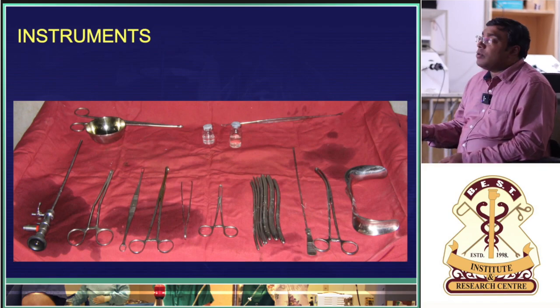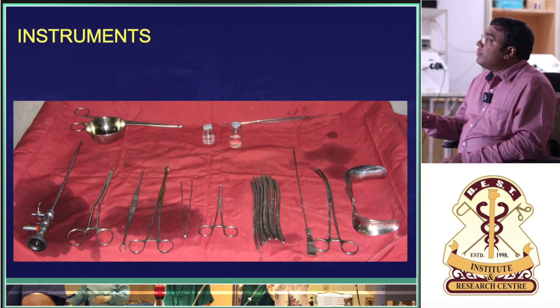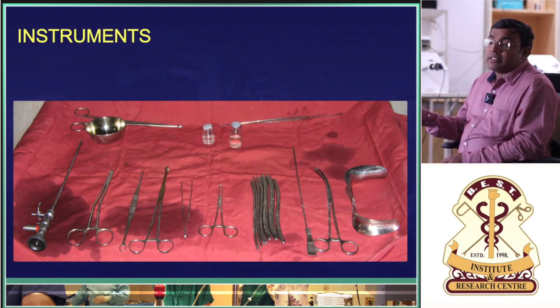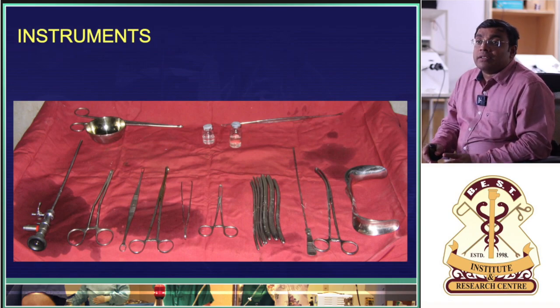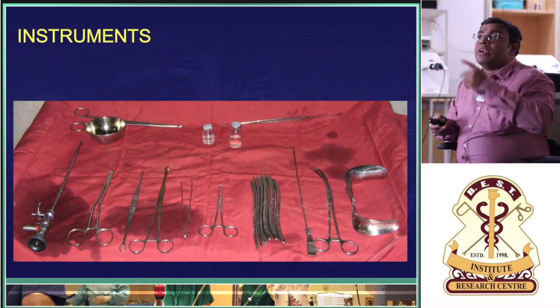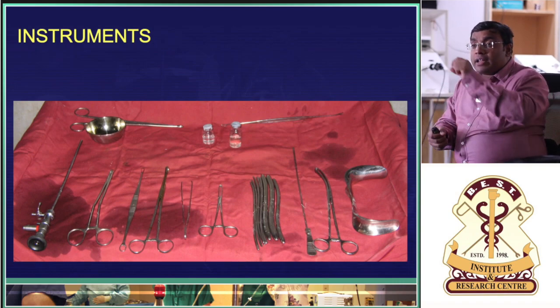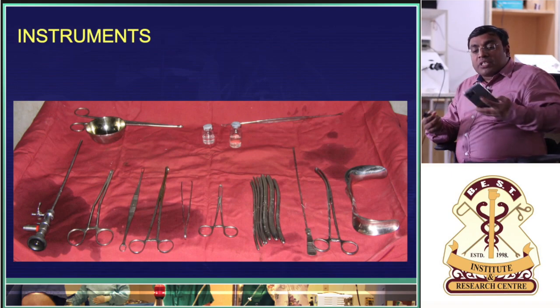So what are the things that you will arrange in your diagnostic hysteroscope trolley? One is the diagnostic sheath and the telescope. Then we have the sponge holders, 2 sponge holders. Then we have dilator sets, sound, vulsellum, 2 Allis are there. Generally we keep 2 Allis. I don't like to use vulsellum, I use 2 Allis. I put 2 Allis, one at 2 o'clock position, one at 11 o'clock position. So the tearing or the cervical trauma is less and the pressure is much better.